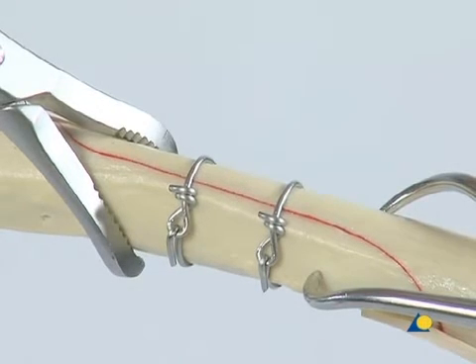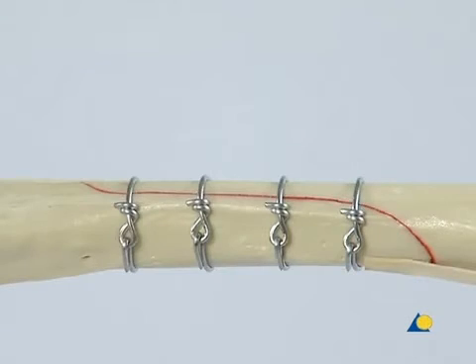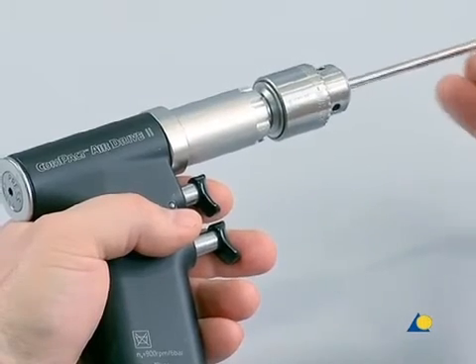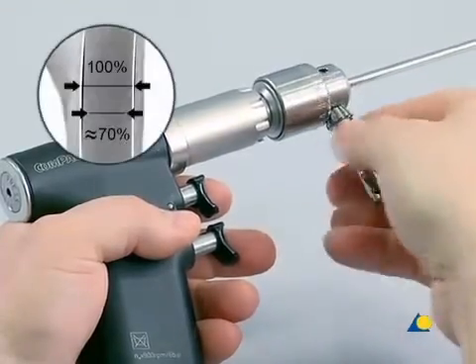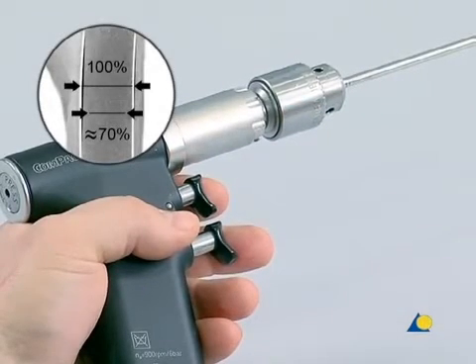Another cerclage wire is applied in the same manner. At this point, both reduction forceps are removed to allow space for cerclage wires at the proximal and distal ends of the fracture. A 4.5 mm diameter intramedullary pin is inserted into the chuck and secured with the key. In a clinical case, when an intramedullary pin is used in combination with cerclage wires, the diameter of the pin should be approximately 70% of the diameter of the intramedullary cavity in the region of the femoral isthmus.